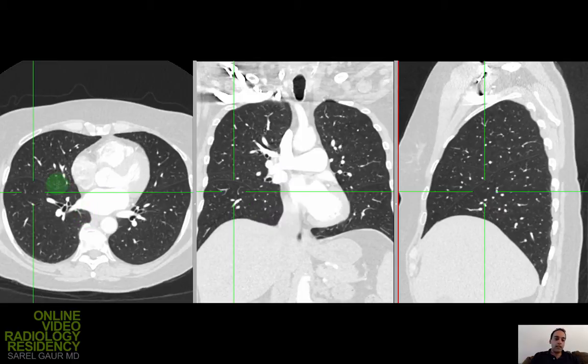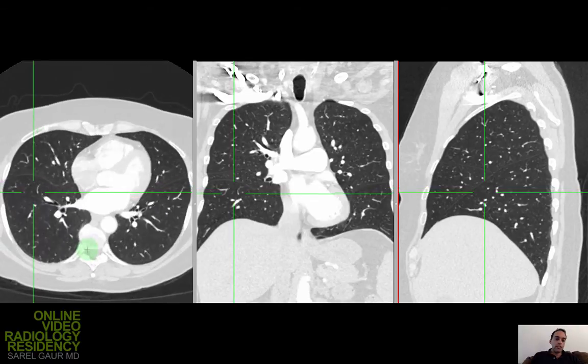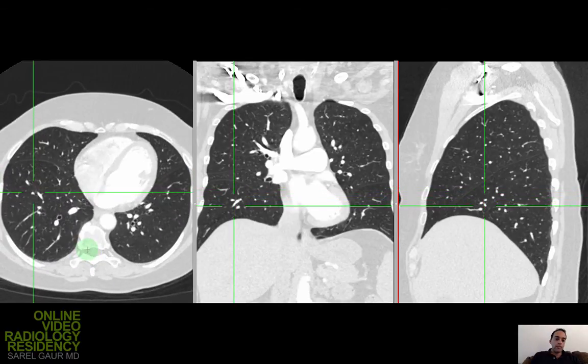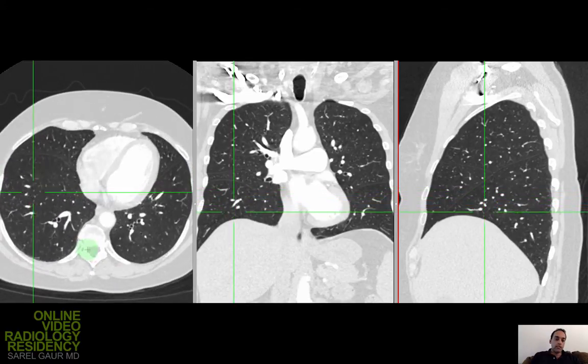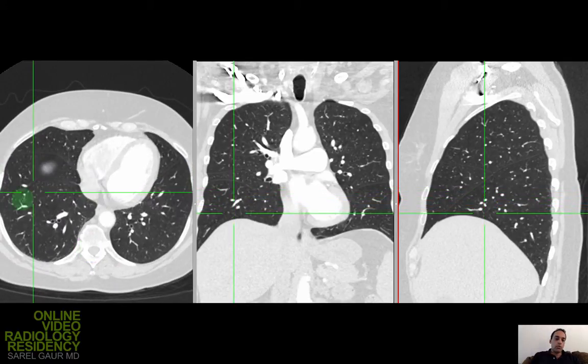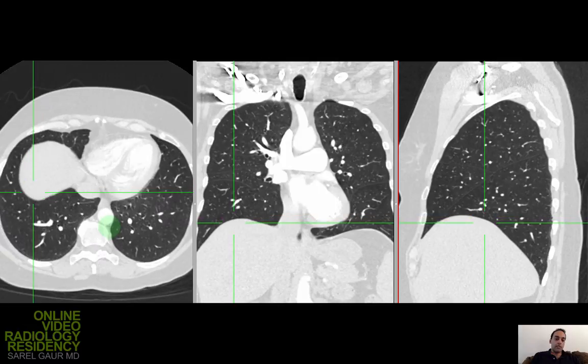Back on the axials, this is the right upper lobe, and this is the right lower lobe. As I come down, you can see more and more right lower lobe coming into the right lung base.